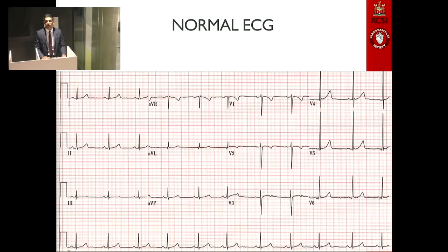This is a normal ECG for you to calculate the PR, QT, and QRS lengths at the end of this session to ensure you know how to do so.